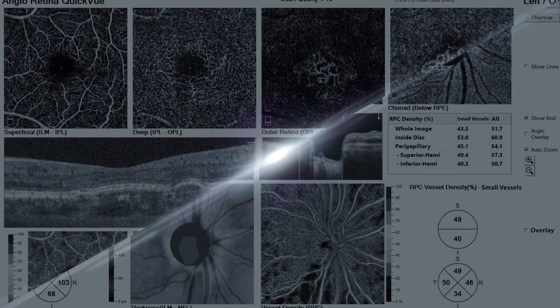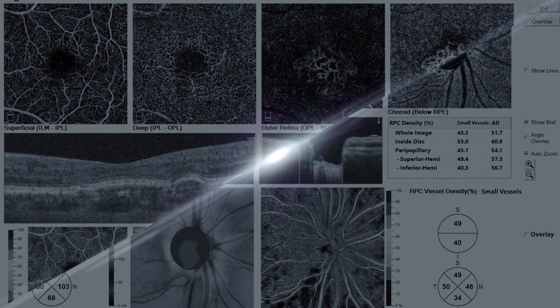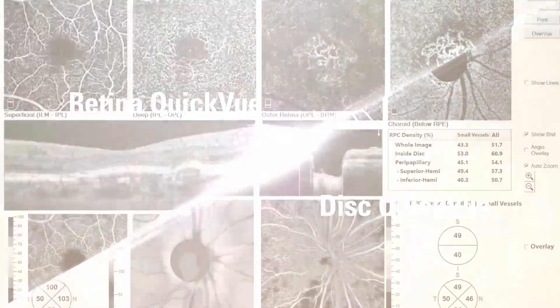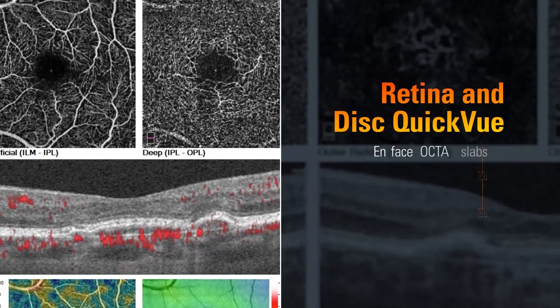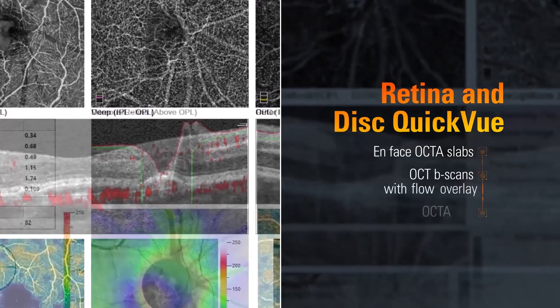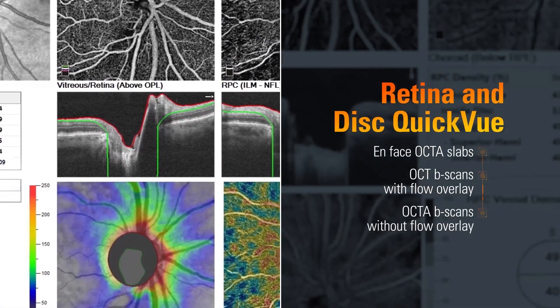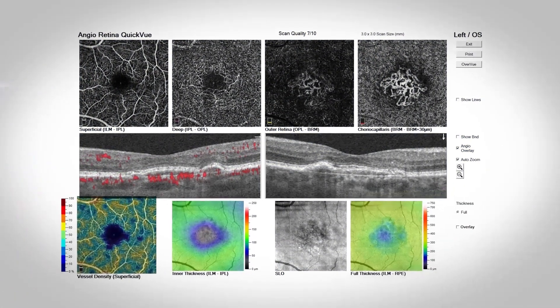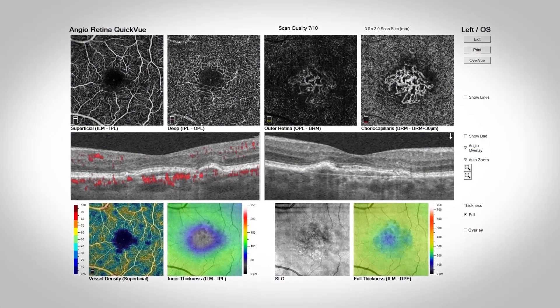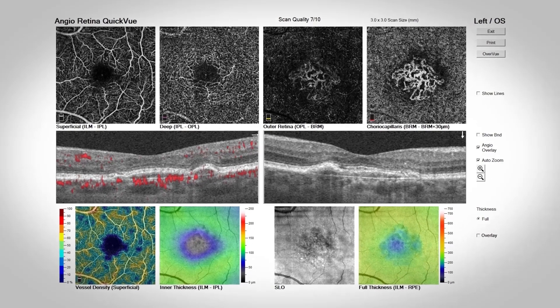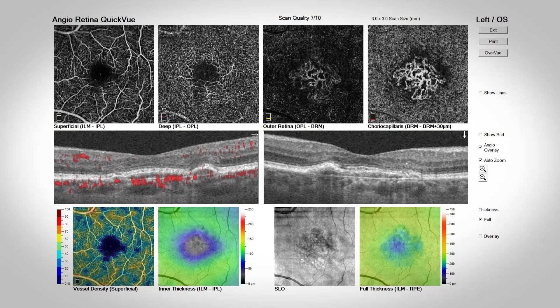Assess retinal and optic disc health at a glance with Retina and Disc QuickView reports. These reports display en face OCT OCTA slabs, plus OCT B-scans both with and without flow overlay. Retina QuickView also shows retina thickness measurements and a vessel density map, allowing for simultaneous evaluation and correlation of structure and vascular integrity.